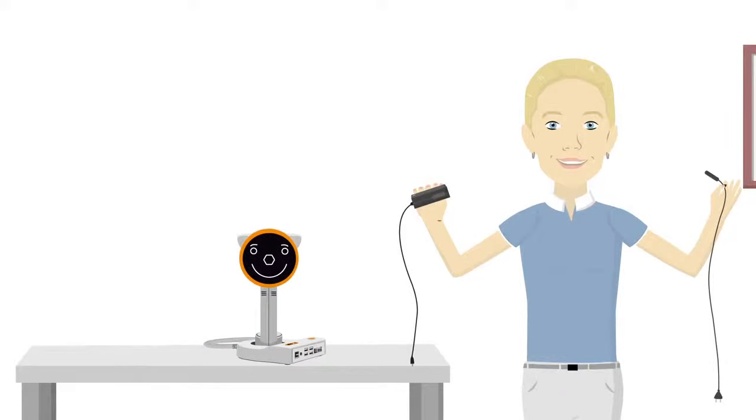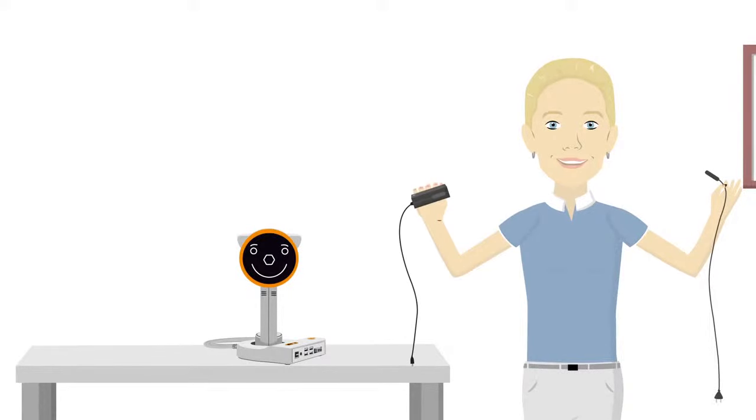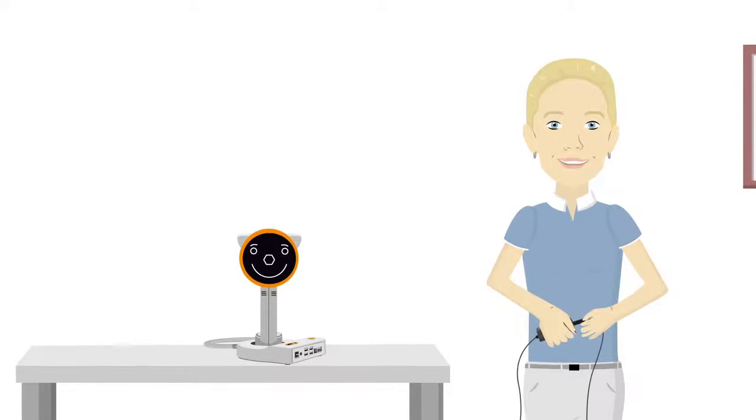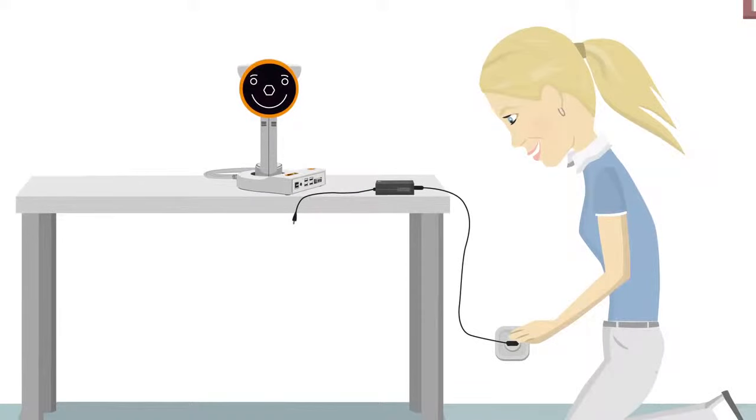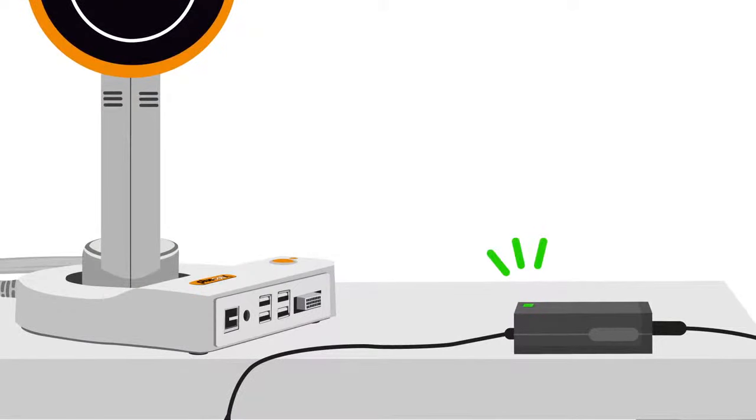It's time for Anna to connect the power supply. Find the power supply and the included power cord. Connect the power cord to the power supply and plug the power cord into an electrical outlet. Look for the green light. The light indicates that the power supply is working correctly.